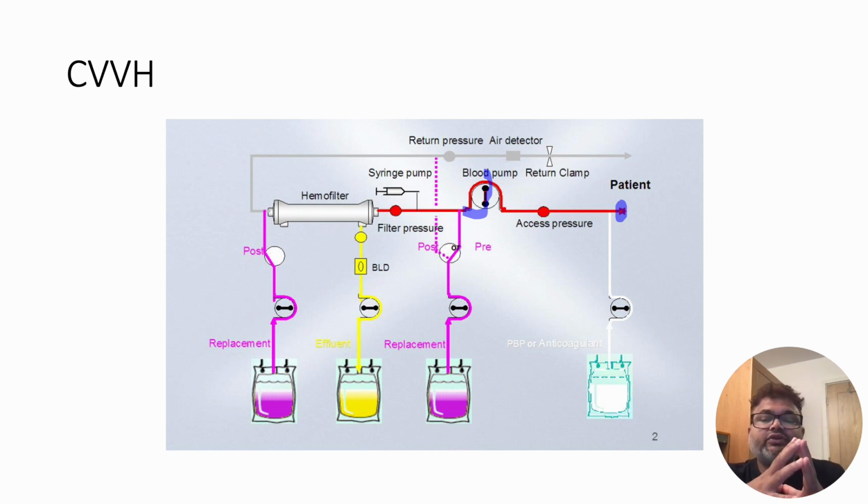So what we do is that we divide the pre-filter and post-filter, and we try to give mostly 2 is to 3 or half and half, either as a pre-filter and post-filter, and we keep watching which patient will suit between what level.